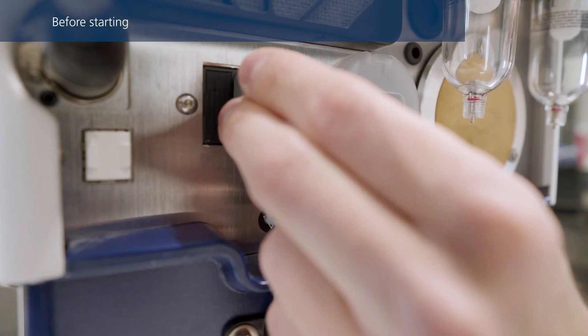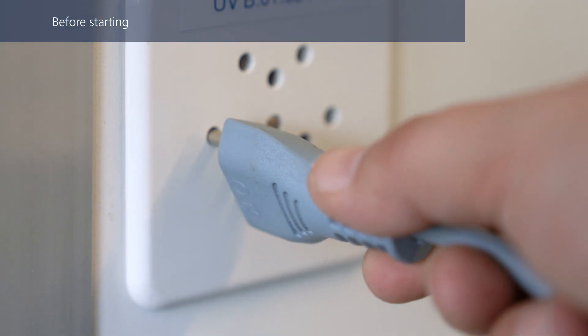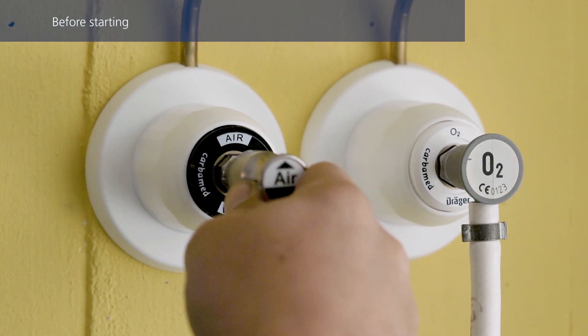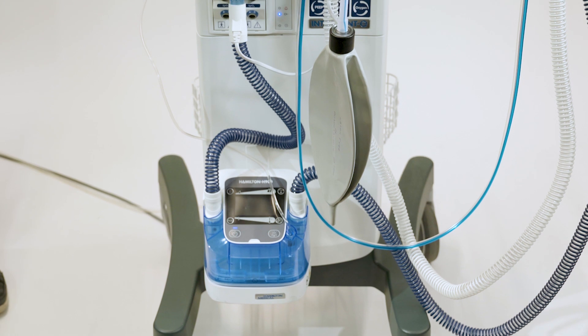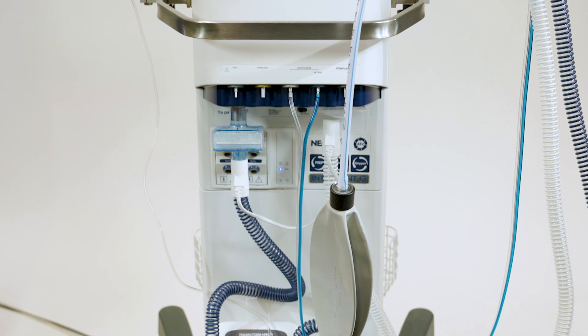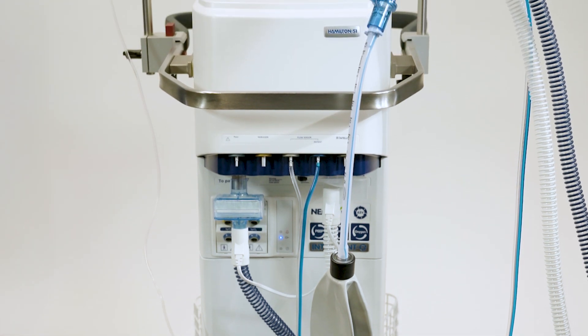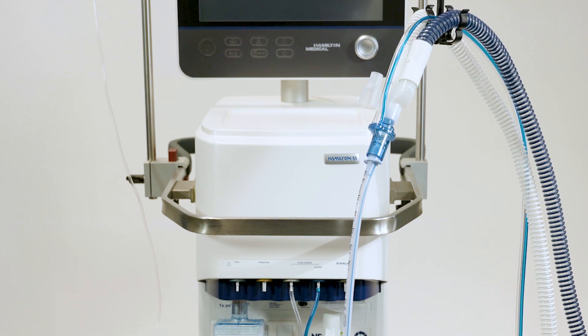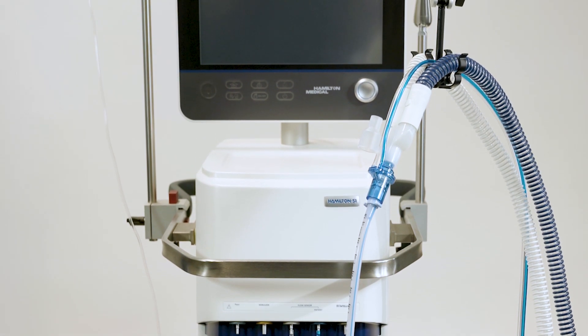Before starting the pre-operational checks, ensure that the ventilator is connected to both primary power and a gas supply. Ensure you are using the correct flow sensor for the patient. If there is a mismatch between the selected patient group and the type of flow sensor connected, calibration will fail. Verify that the breathing circuit is assembled correctly.